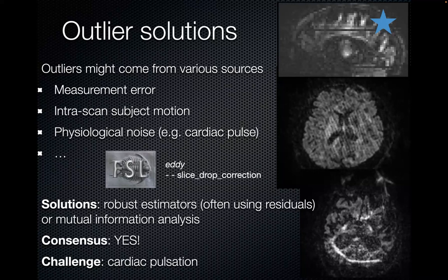It adds a little time, but it saves some data sets. Again, this exploits the redundancy because if suddenly the direction just beside doesn't have that slice drop, you can actually use the neighborhood angularly and spatially to complete and paint the missing data.